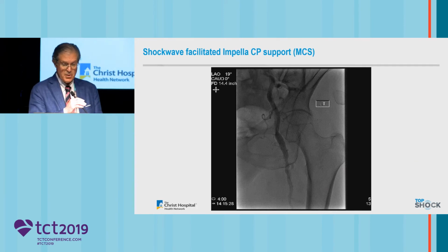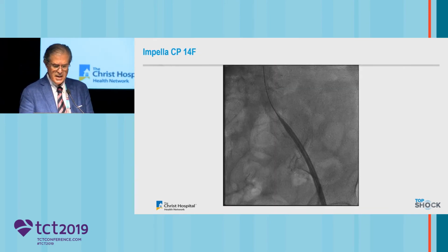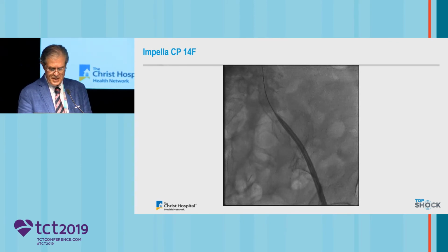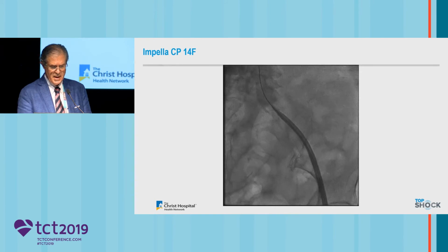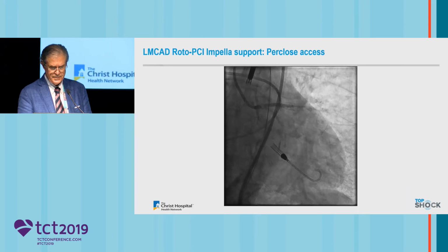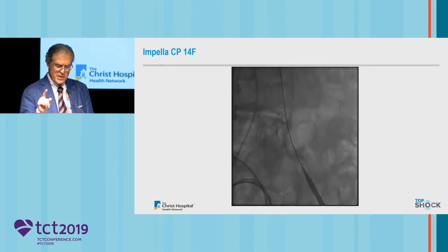This is probably the most explosive area of use, I think, with the advent and development of chip centers around the country. This was our first case published by Robert Riley in our group, and it's in CCI. These videos are in CCI. Look very carefully. This is an Impella CP 14 French without the peel-away sheath, and this is going absolutely nowhere. This is the 7x60 balloon. You look at the density of calcium on both sides. And then look, this is real time.